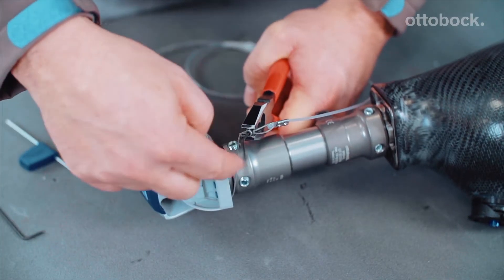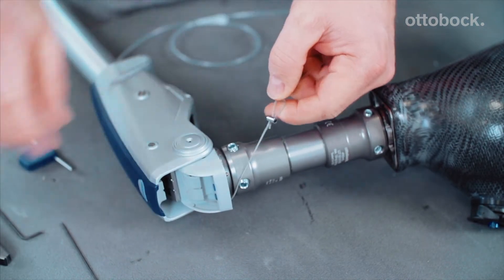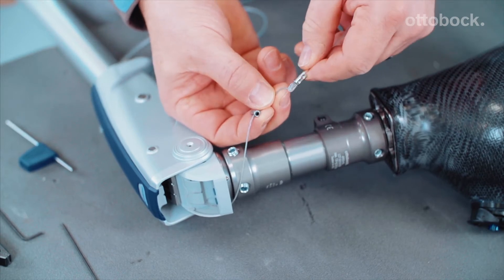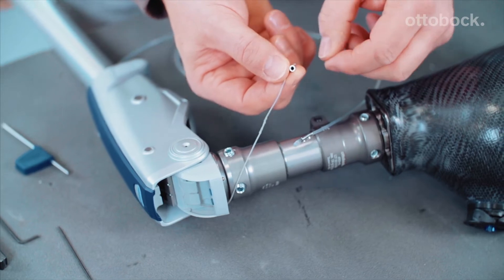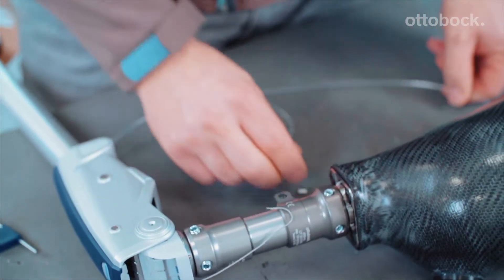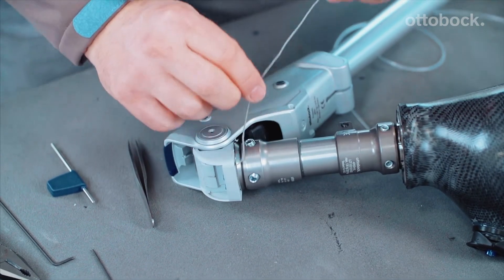To do so, please loosen the small allen screw and remove both the purlon wire and the sleeve. The entire lock release cable is then pulled out and threaded back in the other way around.